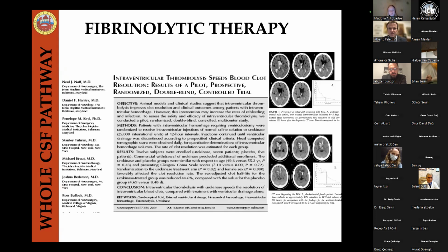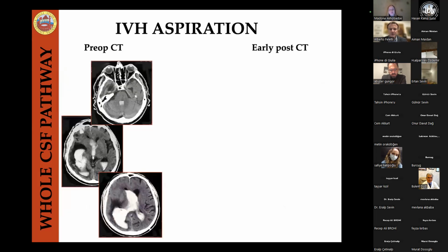For sure, we can use fibrinolytic therapy to speed up the process, but it has been shown by many papers that we still have to wait many, many days before the CSF is cleared using fibrinolytic therapy. But we also know from the literature that the hemorrhagic dilation of the fourth ventricle is the strongest prognostic factor in these patients. And the only way we have to get rid of the blood also from the fourth ventricle and very soon is by endoscopy.